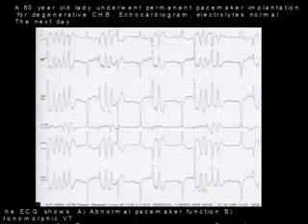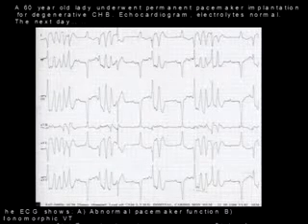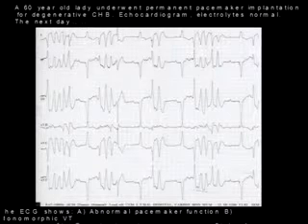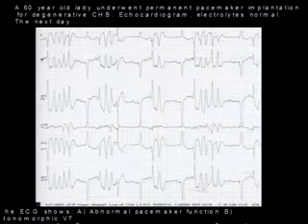Okay. This is number 10. We won't change screens, we'll remain on the screen. To give you a little background, this was a lady who underwent permanent pacemaker implantation for symptomatic, what was called degenerative AV block. Her echocardiogram was normal. The pacemaker was a single chamber pacemaker. It was uneventful. The patient was brought back to the ICU. From the next day onwards, the patient started having arrhythmias and recurrent cardiac arrests. The electrolytes were normal, and she was shocked several times for cardiac arrest.